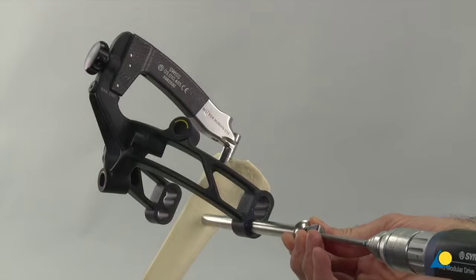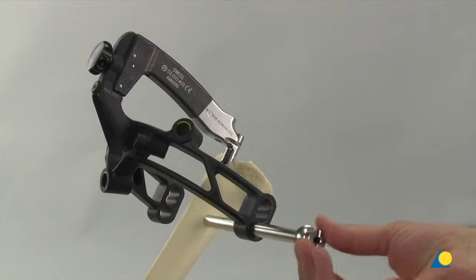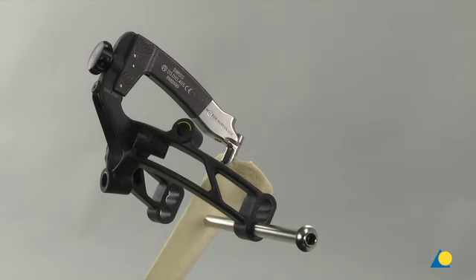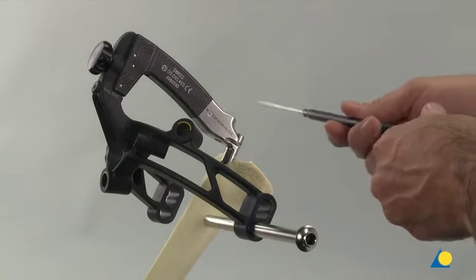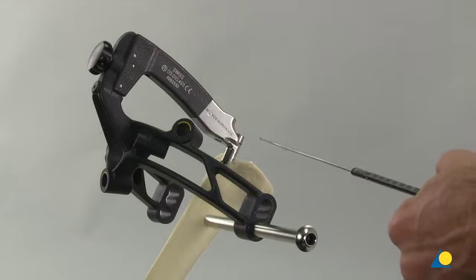The position of the drill bit is confirmed with image intensification. The drill bit is withdrawn and the drill sleeve is removed. The depth gauge is disassembled into 2 parts, the outer sleeve and the measuring device with hook.